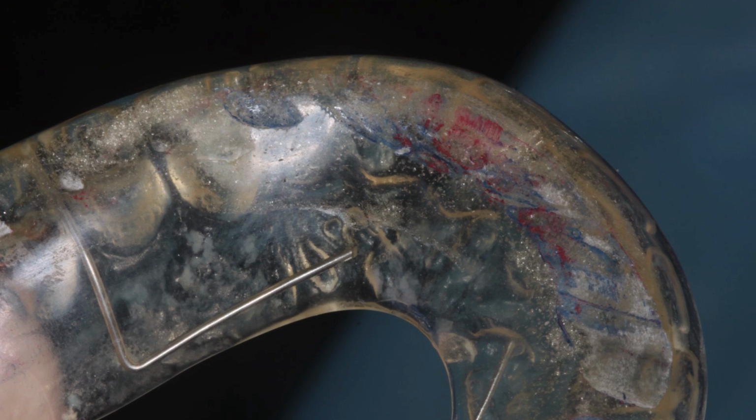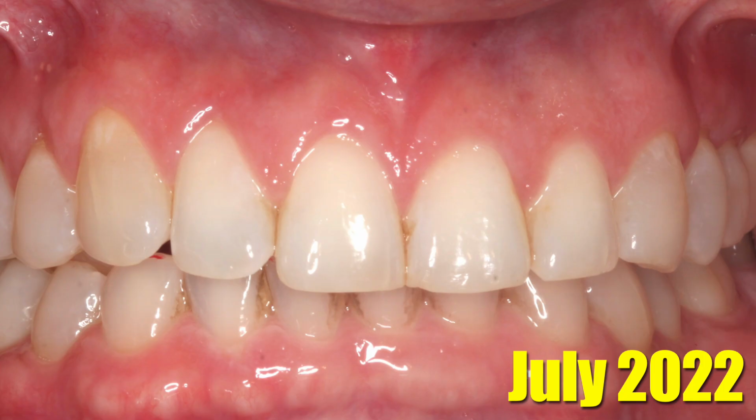We are practically unable to stop the bite forces, especially what we call the nocturnal bruxism, grinding at night, which is very common in cases like this. So having the patient wear one of these devices, and we can replace this as many times as possible, it's simply a matter of cost and the nuisance. But these can be replaced. Bone and soft tissue, and the 2 surfaces that physically wear and get damaged, is very hard to reverse. Although in this case we did manage to reverse to a certain extent.